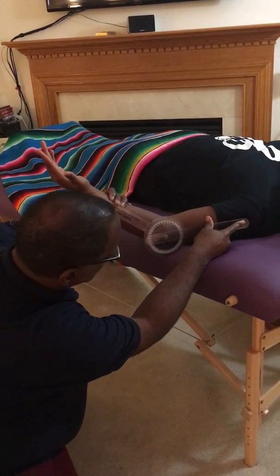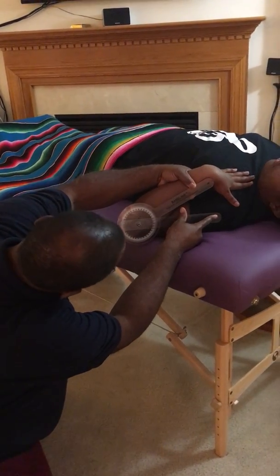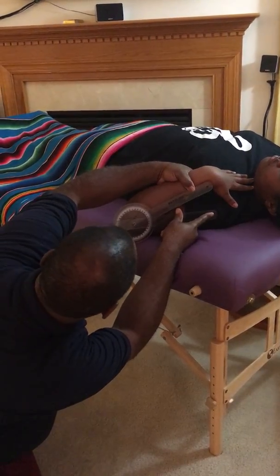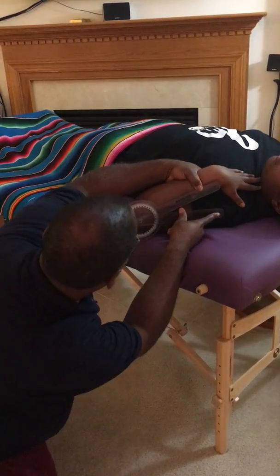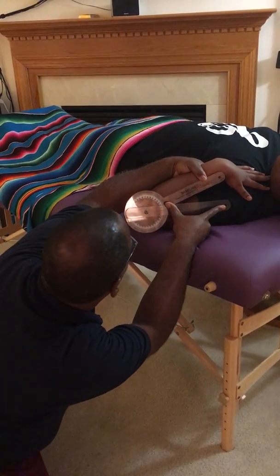Her elbow flexion starts at 40 degrees, all right, and it goes to 100, and let's see, looking at the lighting that's here.